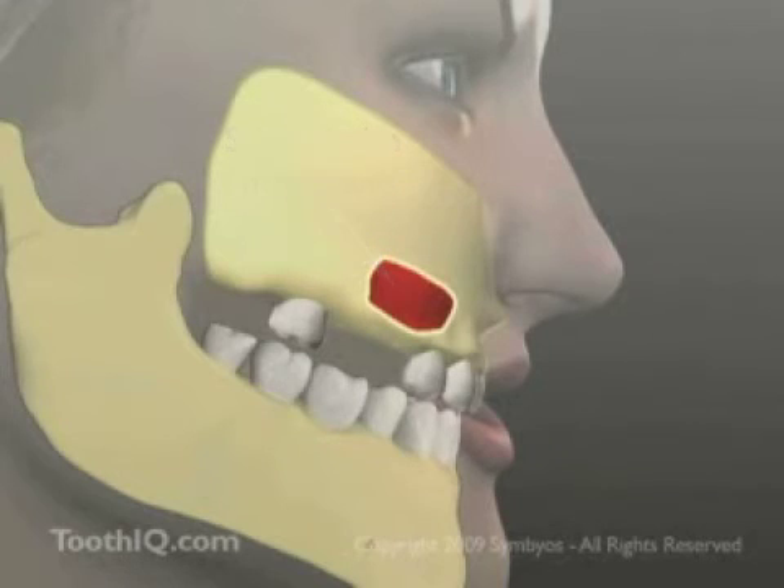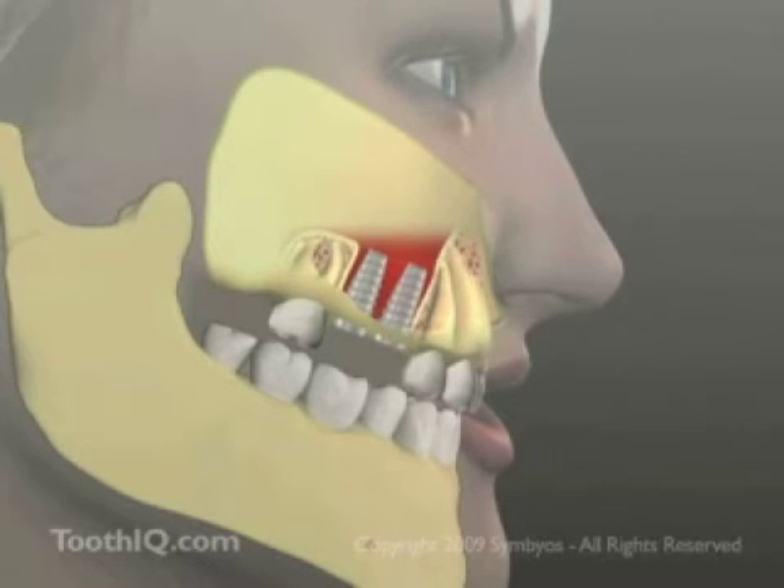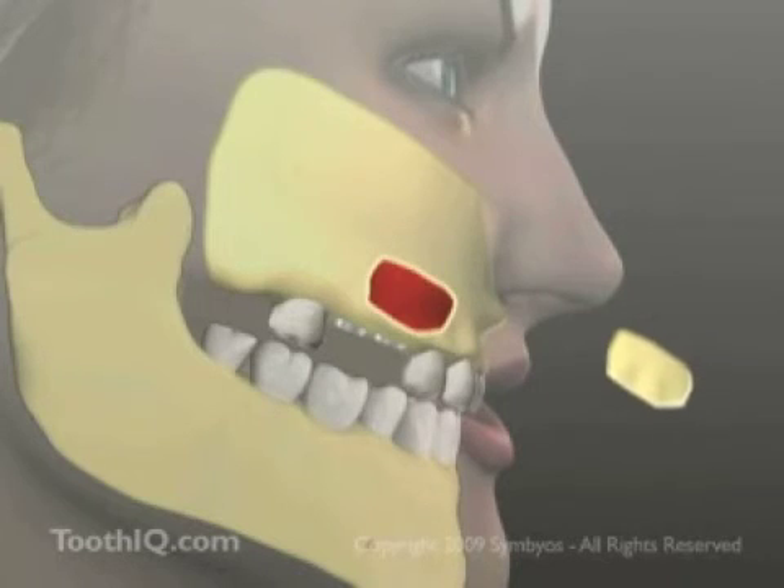Beneath the bone lies a delicate membrane, and care is taken to avoid perforating it. Using special tools, the membrane is pushed back, and powdered bone graft materials are inserted. Dental implants are often placed simultaneously through separate openings in the bottom of the sinus floor. The implants will generally not be restored with crowns for several months, while the graft heals and integrates.